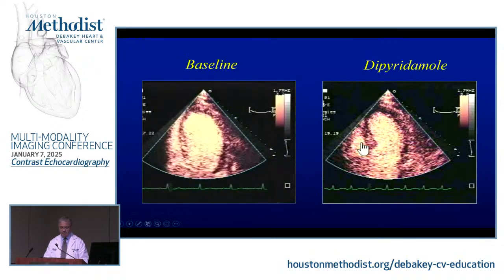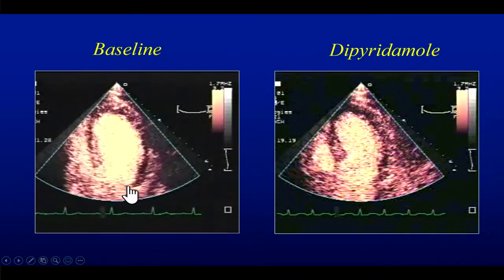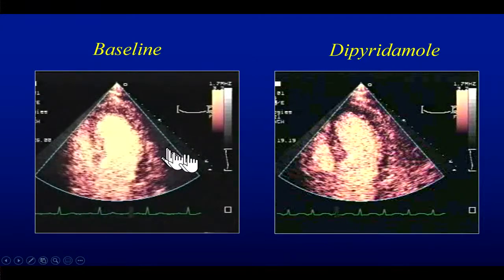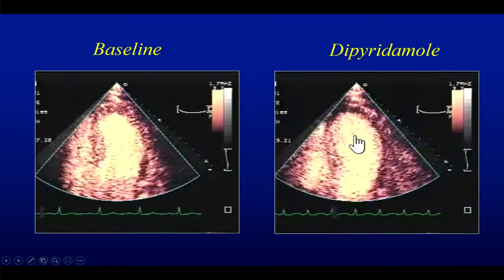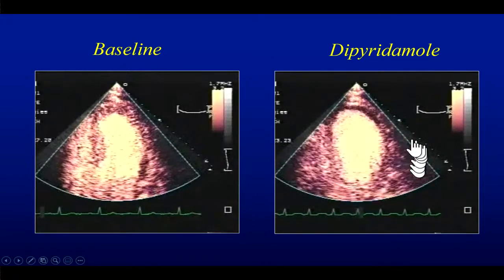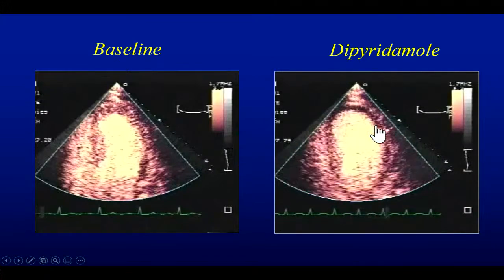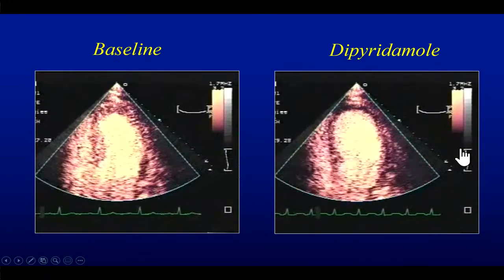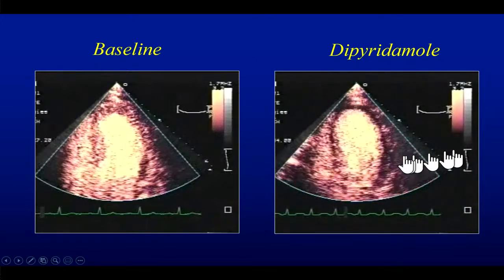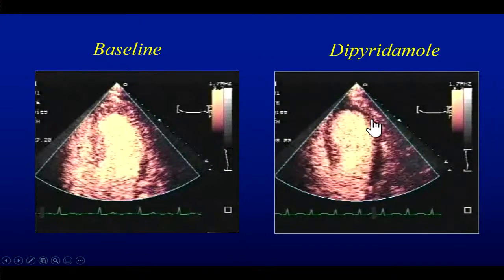And so this is one of our patients. We did a lot of studies in the past regarding that. This is after I destroyed; then I look at perfusion in this individual with an apical wall motion abnormality. Notice what happens during dipyridamole, where you increase myocardial blood flow. Intensity, even in the apex, is down of contrast. And I'm going to hit it with a high mechanical index and watch reperfusion in there. You could see it reperfused, but not in this area here.